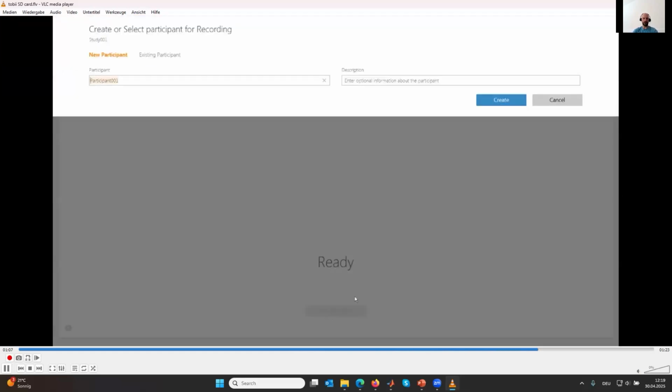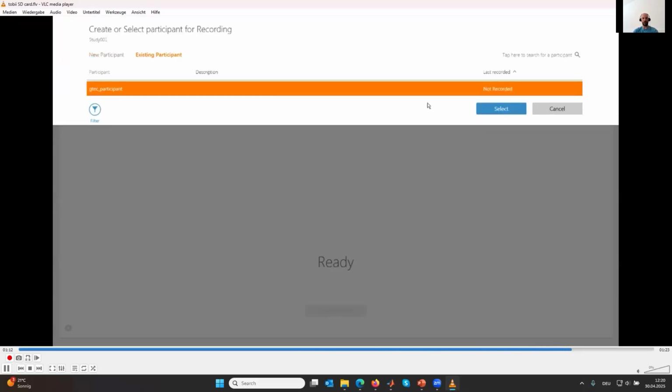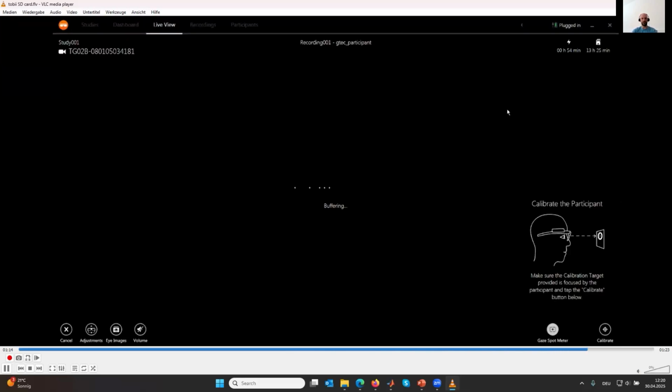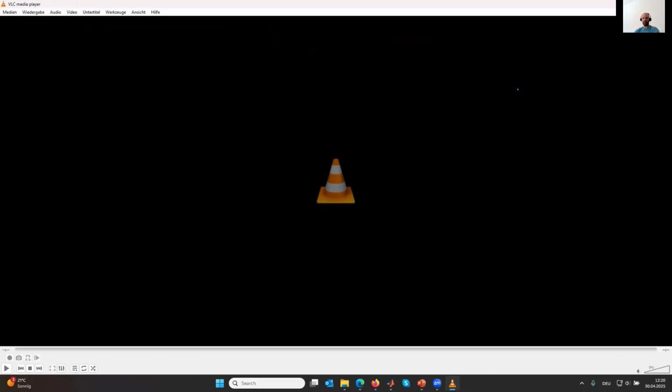And then you start a short recording with the just created participant. Then you're basically done with the SD card initialization. Then you're ready to go.